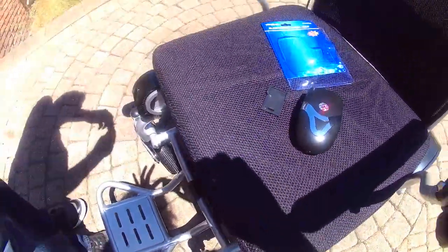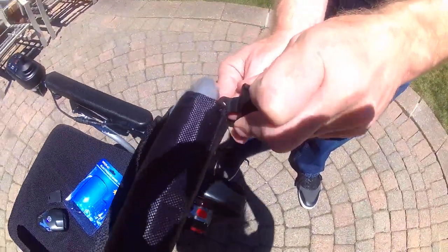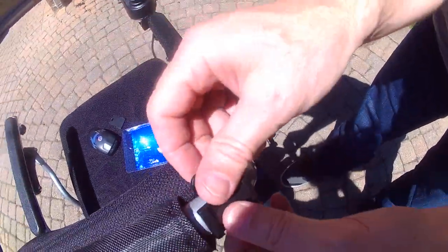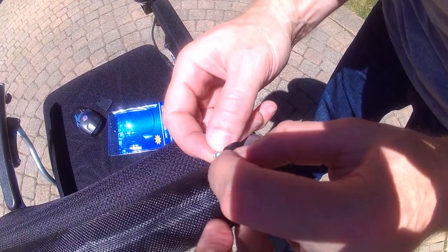I will take this mounting bracket and mount it on the back of the chair. This piece of equipment will mount wherever you would see tubing on your chair.